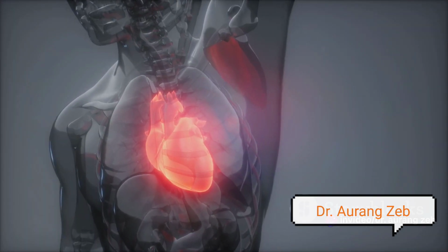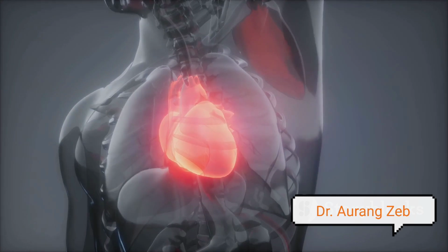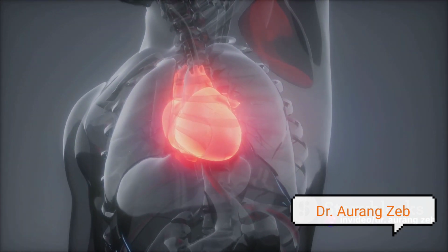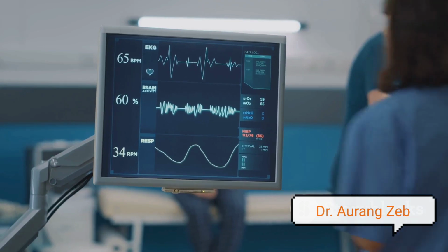Last but not least, we have the subcostal view. This view is obtained from beneath the rib cage and provides a unique perspective of the heart. We can see the atria, ventricles, and the inner atrial and interventricular septa. Here we assess septal defects, pericardial effusion, and the size of the inferior vena cava.